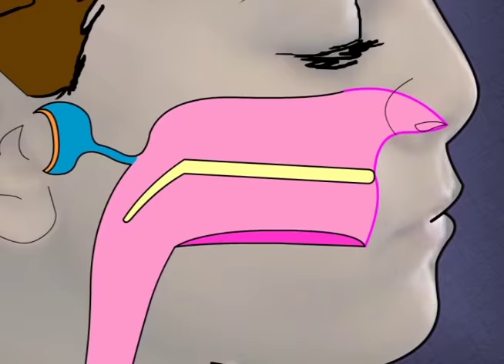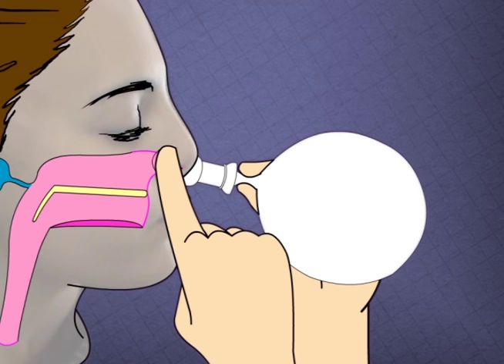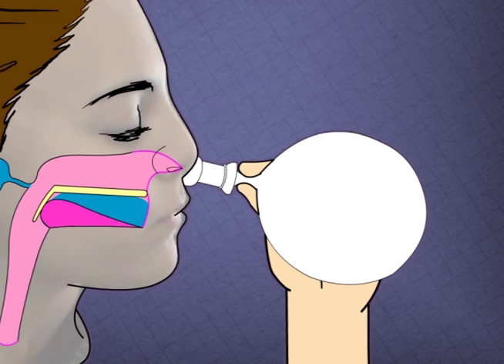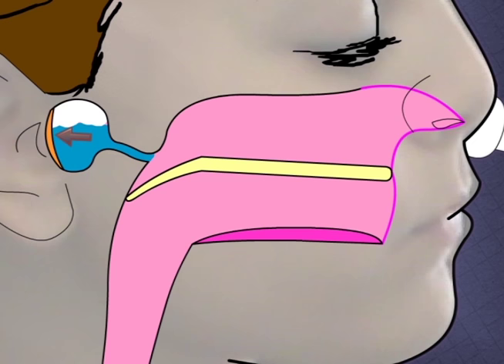Here you see that the balloon, already inflated with air, has been placed in one of the nostrils. The left hand pinches the neck of the balloon and the right closes the other nostril. First we have the patient put water in her mouth. Then the air is allowed to start flowing into her nostril. Then we ask her to swallow the water. This raises the soft palate, closing off the nasal chamber. As a result, the air flows into the Eustachian tube and up into the middle ear, causing the eardrum to bulge out. Once the swallowed water has gone down the throat and our patient is breathing again, the high pressure in the middle ear forces out some of the fluid from the middle ear.